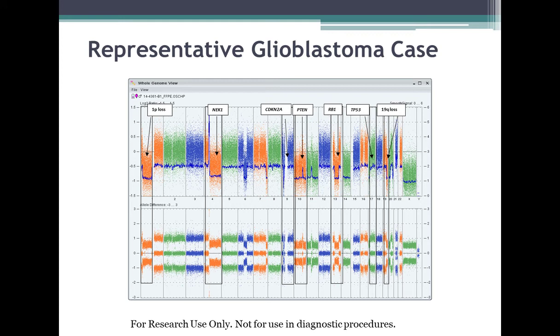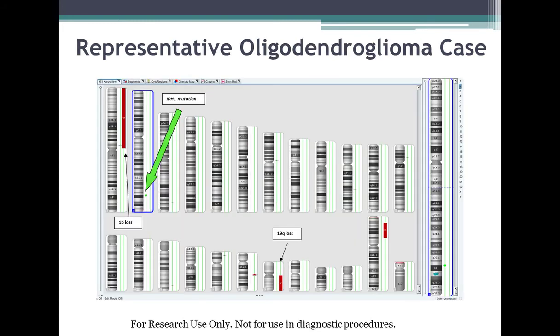This is again a whole genome view of adult brain tumors, which looks at different genes which are dysregulated on an adult brain tumor case, which again is very critical in analysis based on the new WHO classification of adult brain tumors.